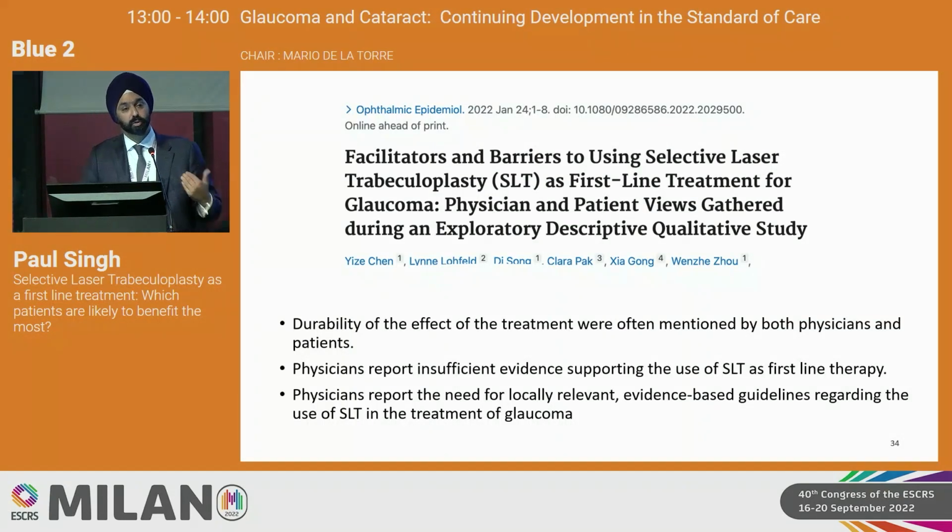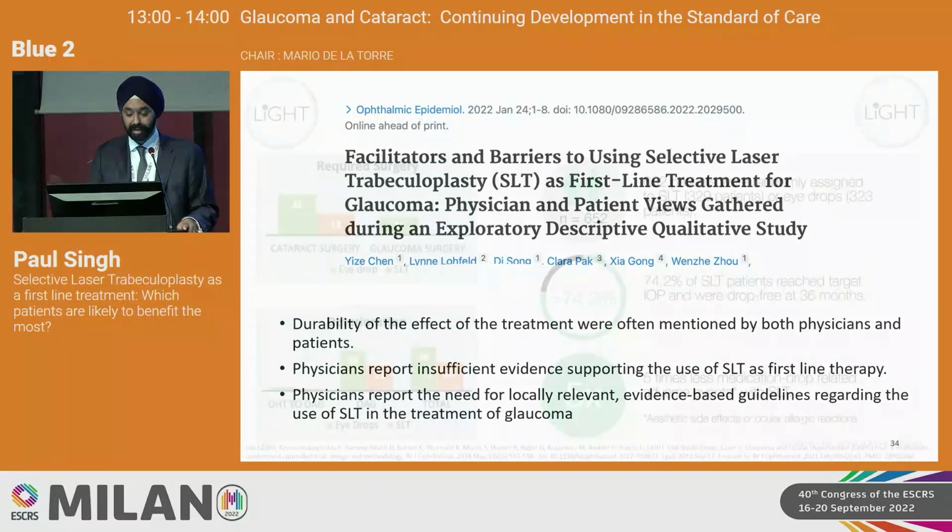And what are the reasons why doctors are not comfortable performing SLT first line? Is there still a thought there's not enough data out there to actually support primary SLT as working, and that we have repeatability? I'm going to share with you a number of data sets that really do show us primary SLT is actually probably a better solution than drops.